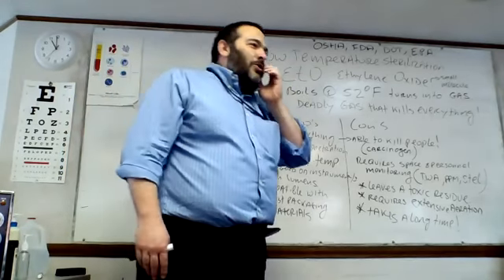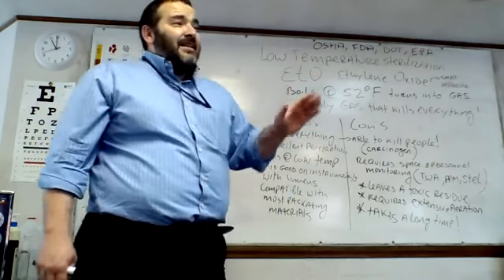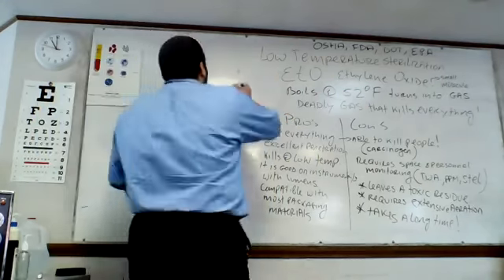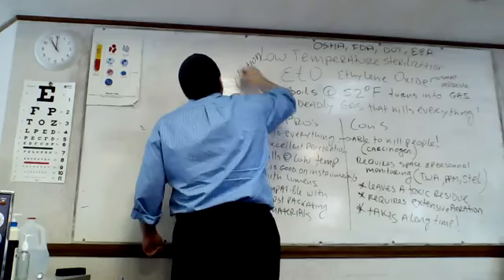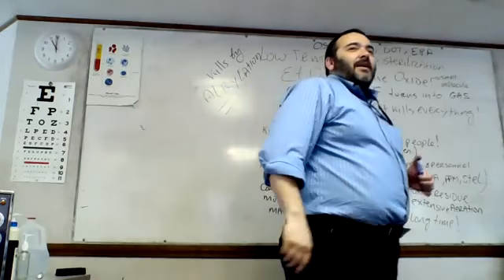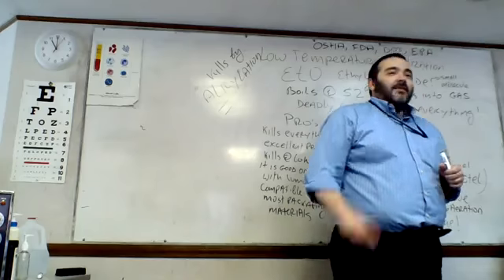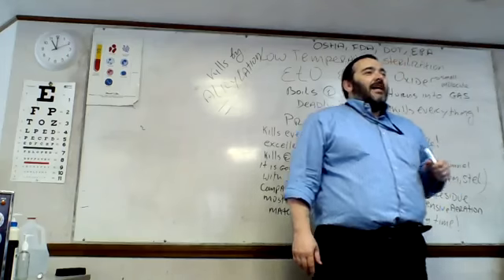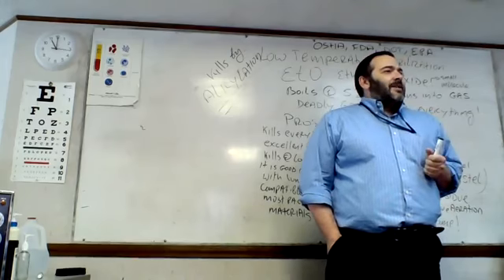And I gotta tell you, there's only one other thing that I have to put up over here. Remember I told you that steam, for example, kills by temperature and pressure? Well, ethylene oxide has none of these things. It has no temperature, no pressure, right? So it kills by a specific process. And this process is called alkylation. So it kills by alkylation. Means it alkylates something and it is dead. Too sweet. Well, not so too sweet because it takes almost a day, but you know what? It will die. Make sense? Not rocket science, now is it?